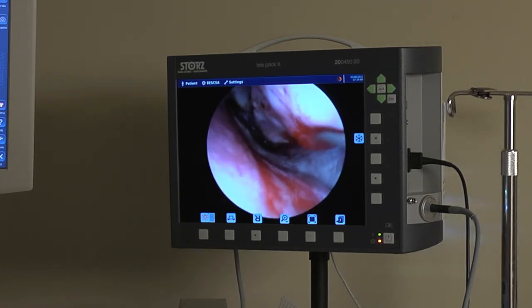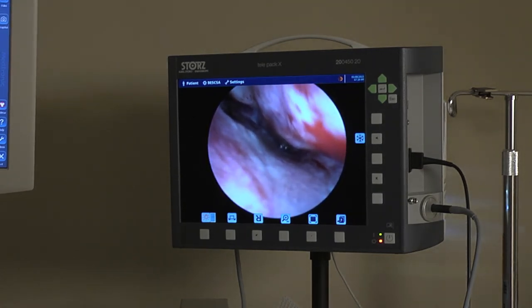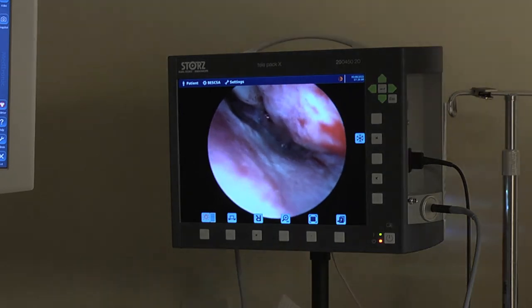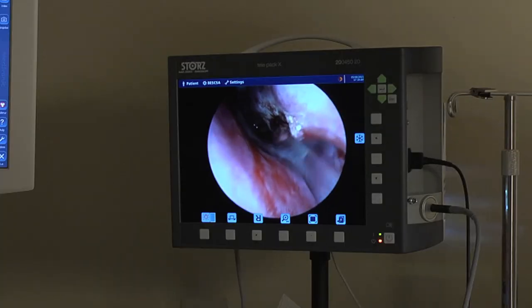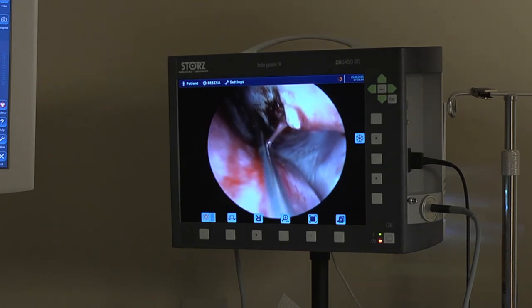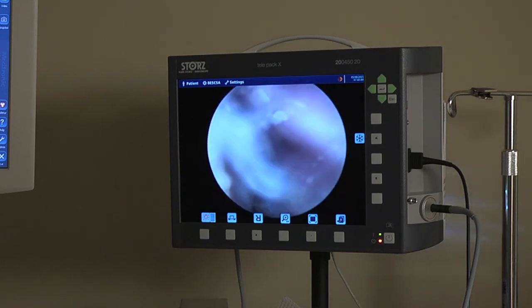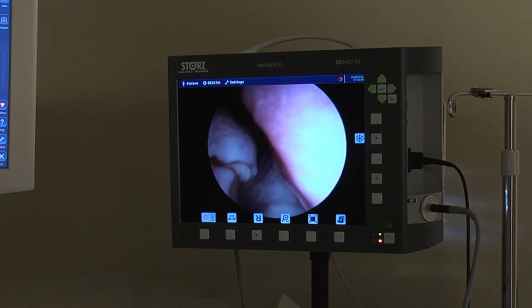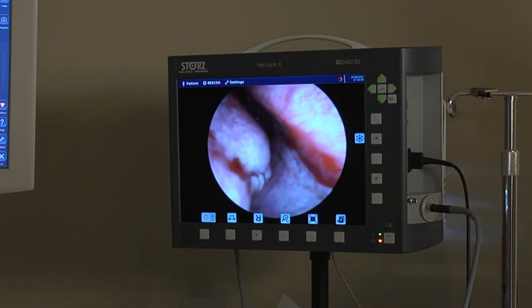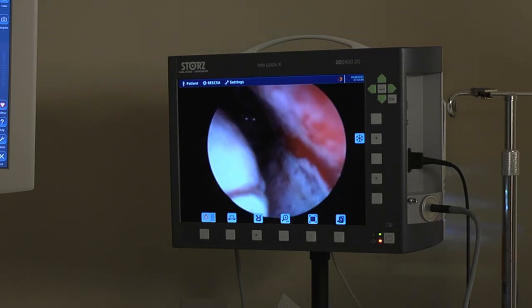So I'm going to put this ablation needle in here. You might be able to see it — you can kind of see that shrinking right there. This right here is your inferior turbinate, and this over here is your septum. You breathe in this area right here, which right now looks nice and open. But that's because I've sprayed Afrin in the patient's nose and the turbinates have shrunk up. But when your turbinates get enlarged, this is when people complain. Sometimes they can't breathe from the left side, sometimes the right side, or when they lay down. All that's turbinate congestion.